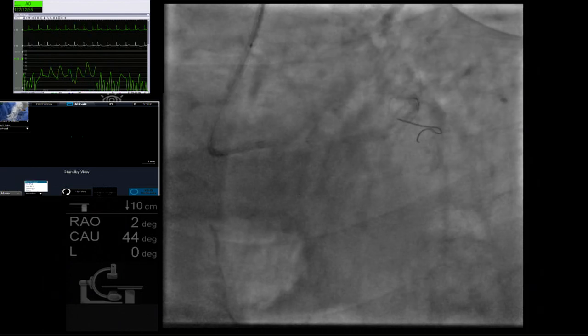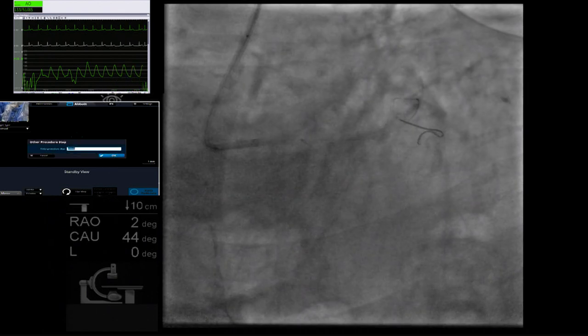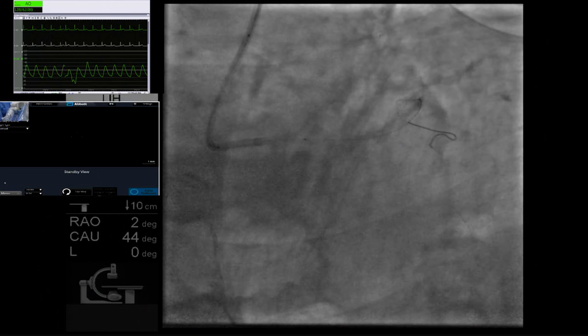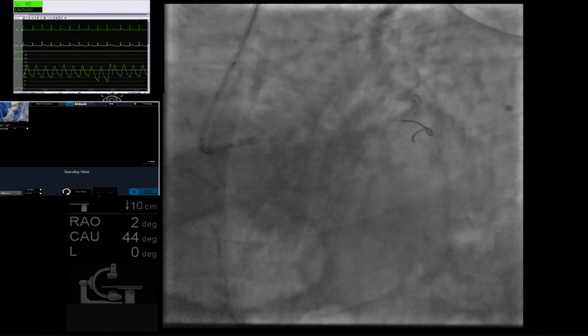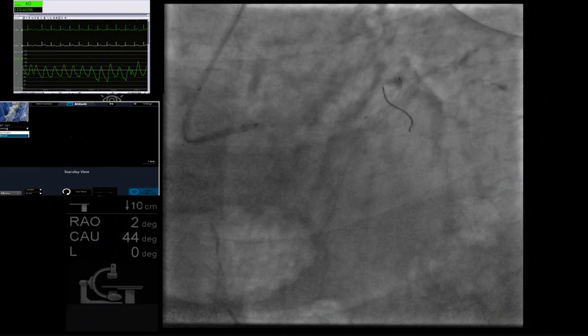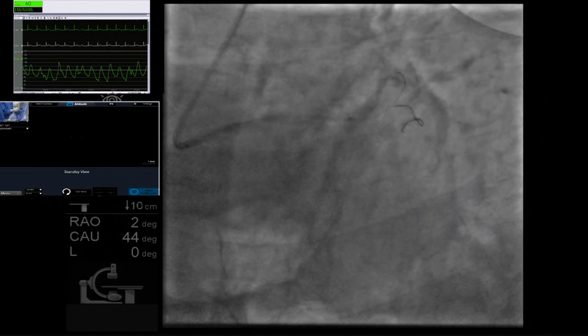Another thing I do is, at times there is some resistance, like the loop, there is a distal loop. So I will hold both wire and OCT catheter together and push. And then it goes more easily and smoothly. I pull the wire back, again do the same thing, and advance the catheter.